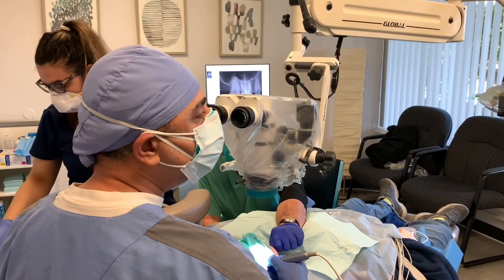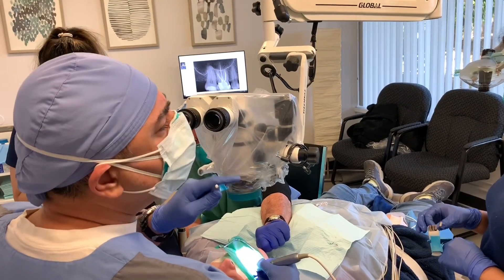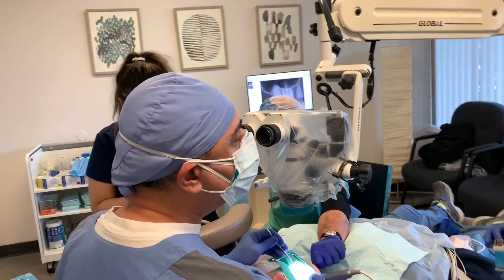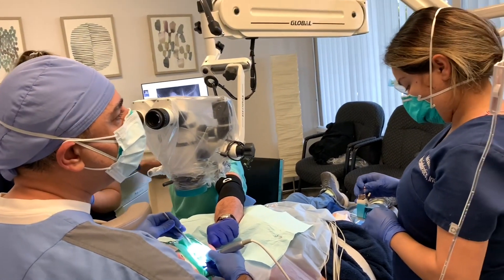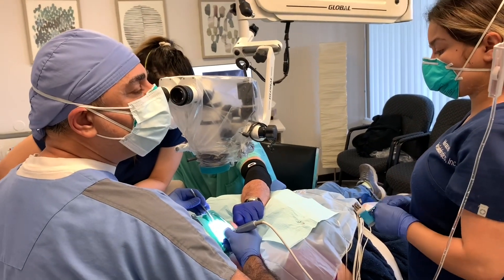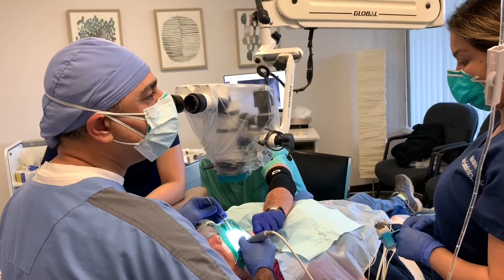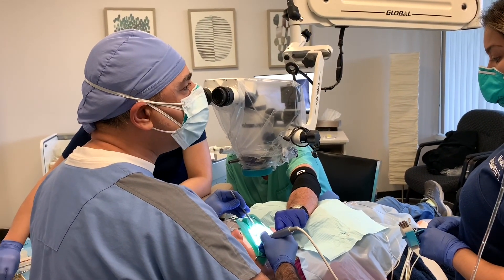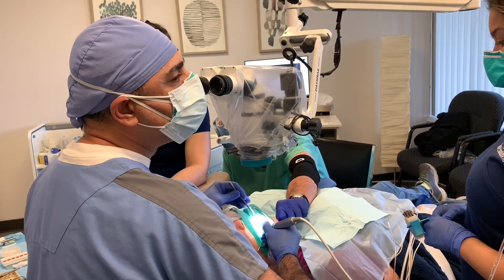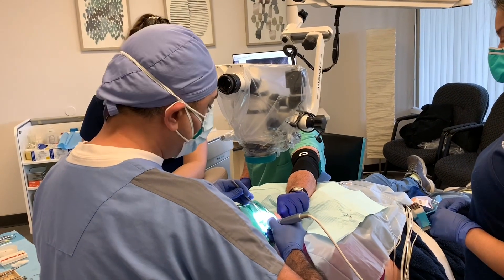Forget about all the conventional assumptions — if the mesial root looks concave on the X-ray, that's all incorrect. You need to follow the pulpal floor map. Right now my MB2 is about a millimeter away from the palatal canal orifice. MB2 can be anywhere; all you need is magnification and the ability to read the pulpal floor anatomy. I'm now in the MB2 with a size 08 C-file in a reciprocating motion.